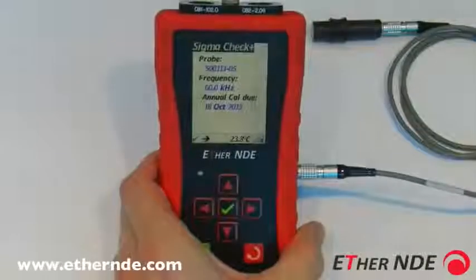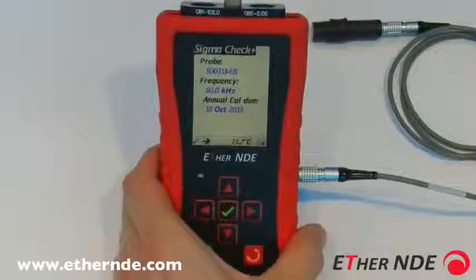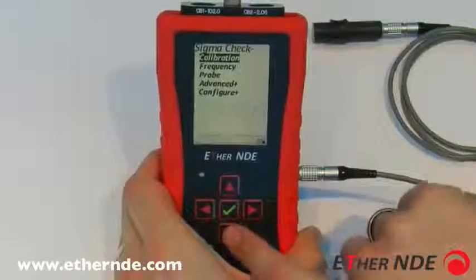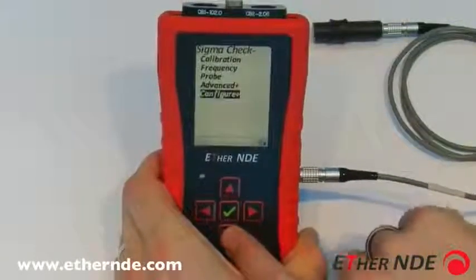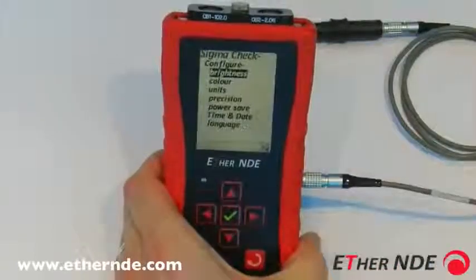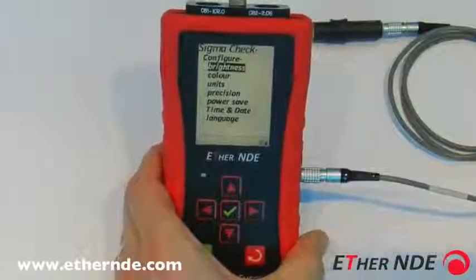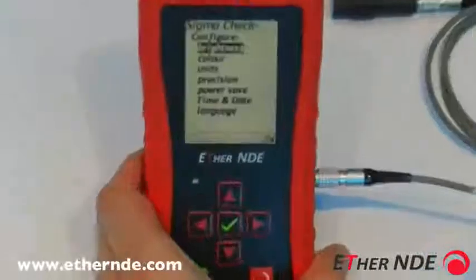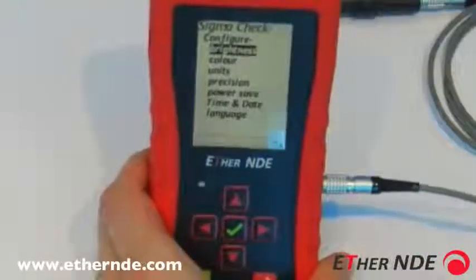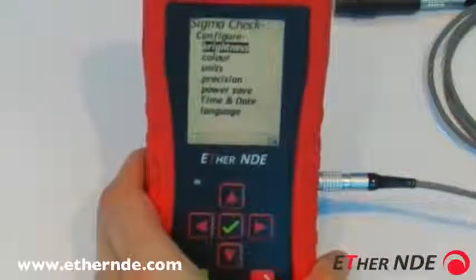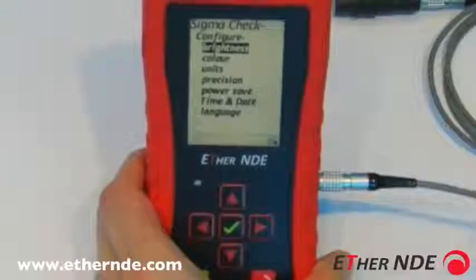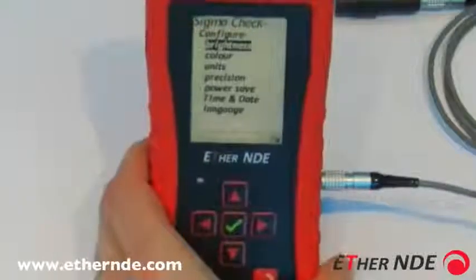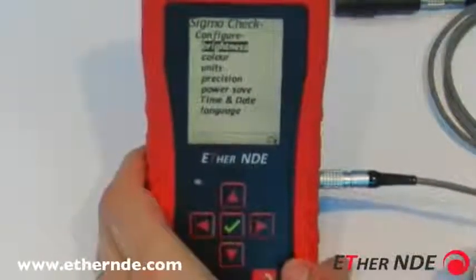How to configure the Sigma Check to your personal preferences. If we go into the Sigma Check menu and then down to the configure submenu, you can see various options: brightness, color, units, precision, power save, time and date, and language. Most of these are self-explanatory, but I'll go through and give a brief description of each one.